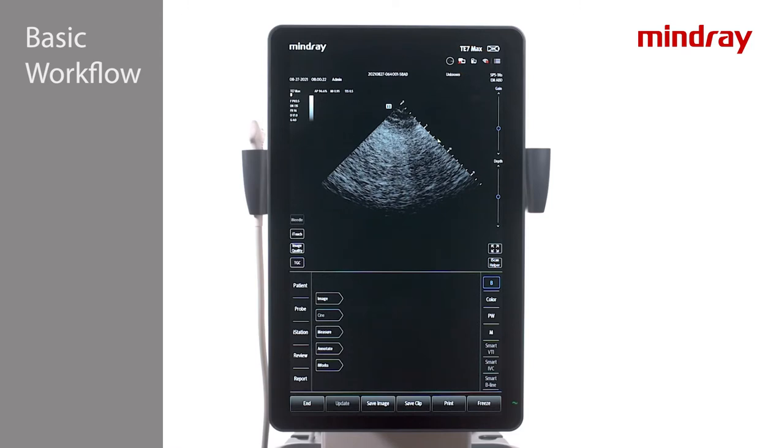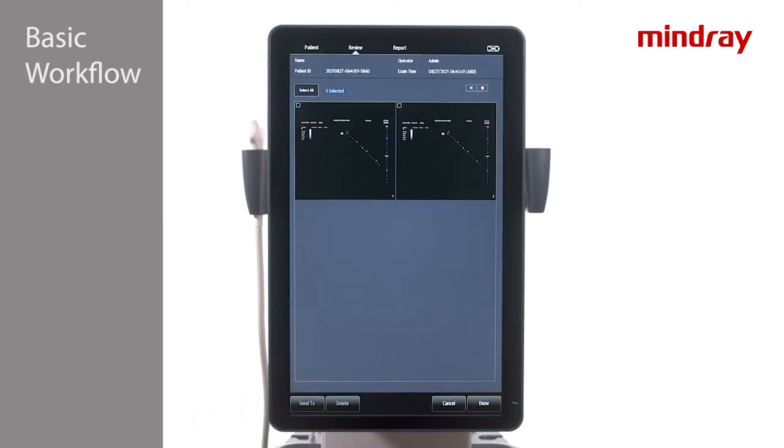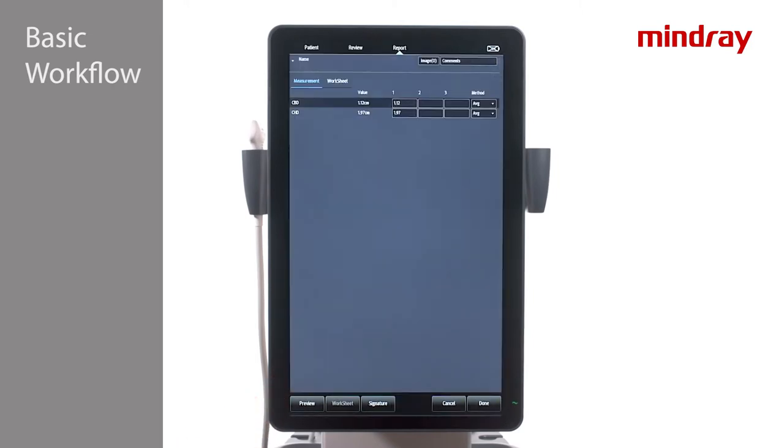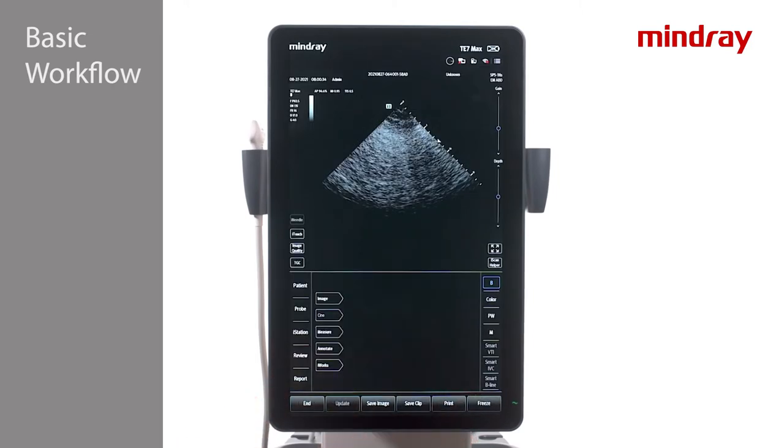Returning to the basic workflow tabs, any images or clips taken during the exam may be reviewed with the Review tab. Tap the Report tab to see or edit any measurements taken during the exam. Finally, when you are finished, press End.